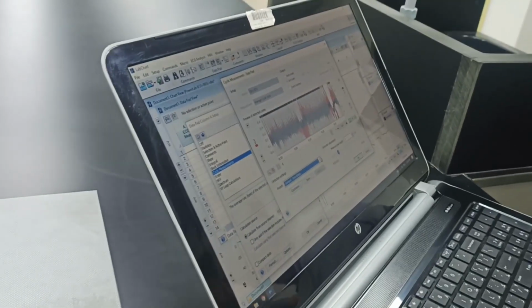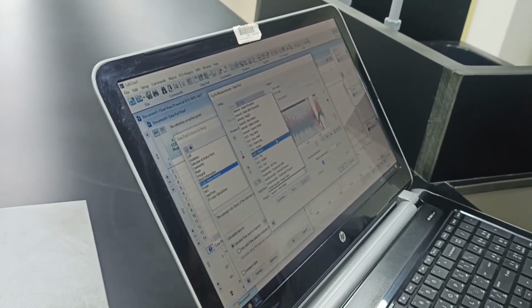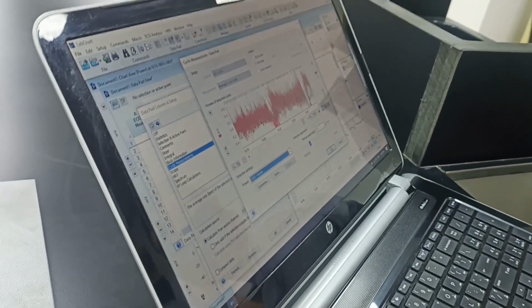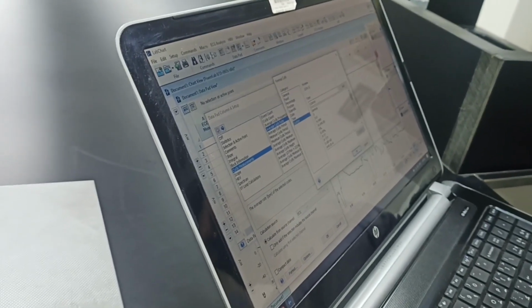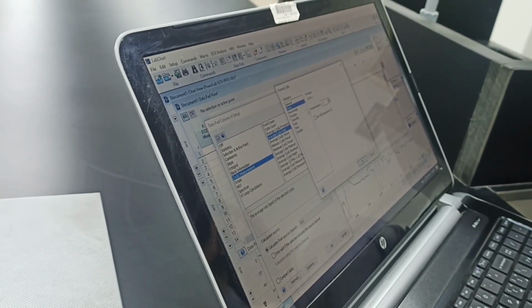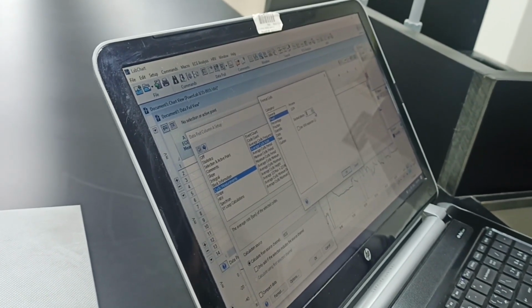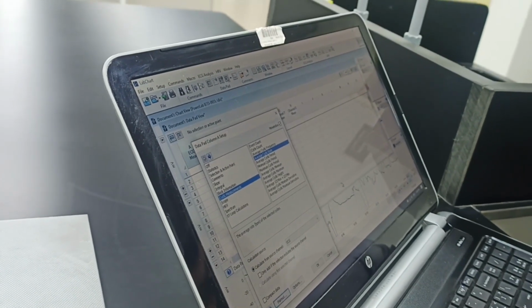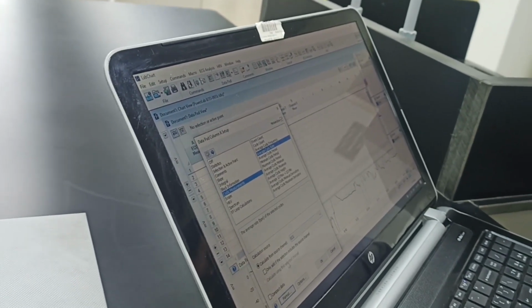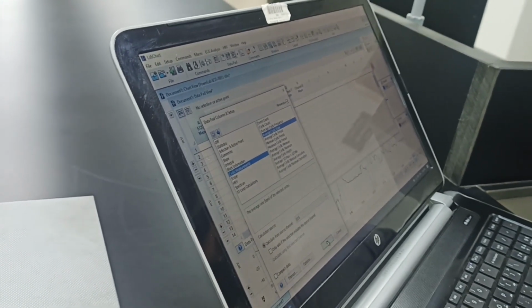We'll go to the options and convert it not as general sine wave, but ECG human. Now it will be able to detect most of the peaks automatically. And we will also set a format that we want, decimals or no decimals, because this will be automatic. So we fixed the changes we made in the beginning, right? Because it wasn't ECG then. Yeah, now we are configuring it.